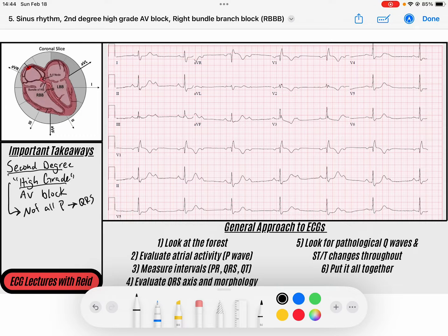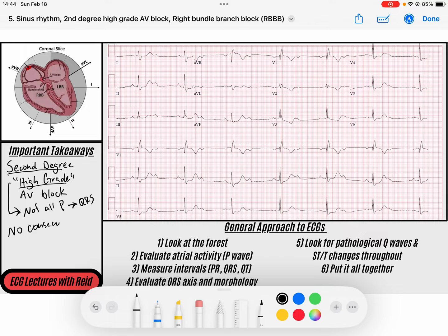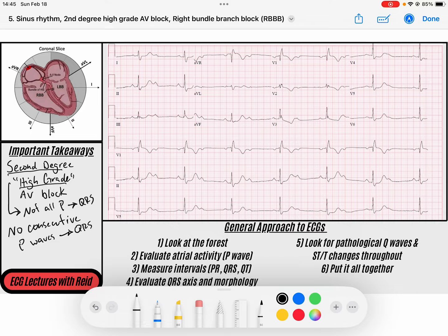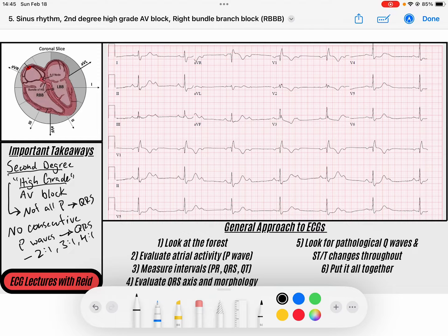There's a third subtype of second degree blocks that is really important to delineate — it's called a high grade block. What that means is that no consecutive P waves conduct to a QRS. So there could be, for example, 2 to 1 conduction, where for every two P waves we conduct one to a QRS, or 3 to 1 conduction, or 4 to 1 conduction.